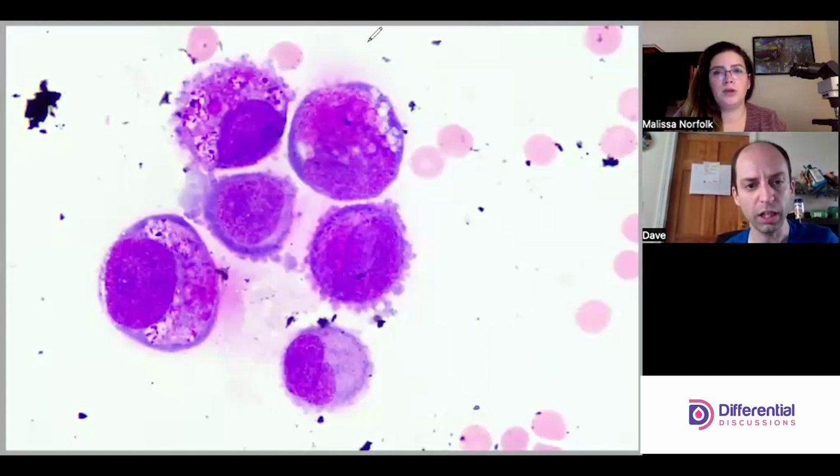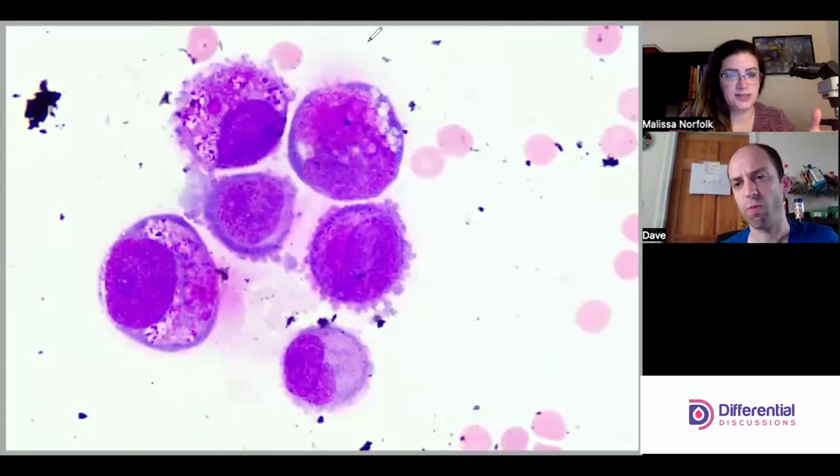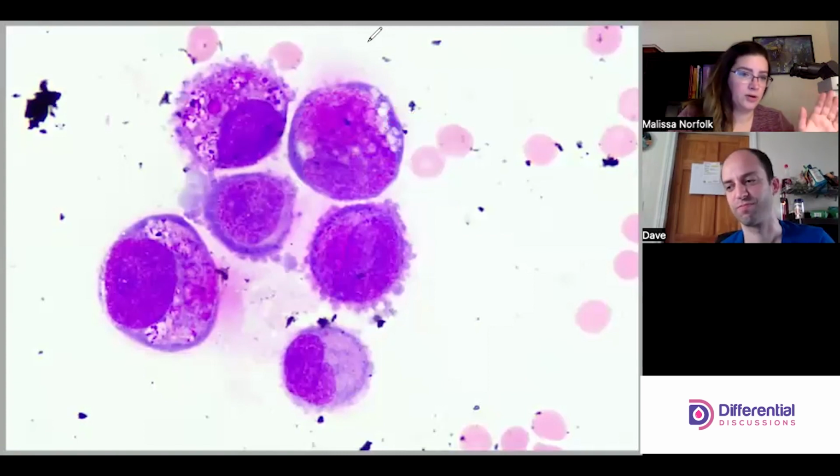I think another thing that lends it to being more of a cancerous cell is when we talk about lining cells, like we talked about with synovials, and we'll talk about it with the ascites and the pleurals and peritoneals. We talk about how they have little blebs and how you can see the interconnections between the different ones.